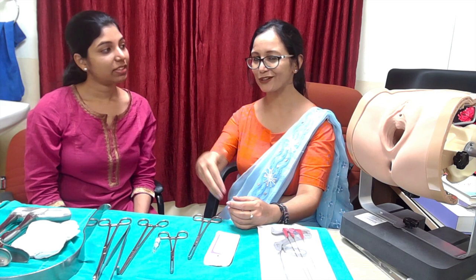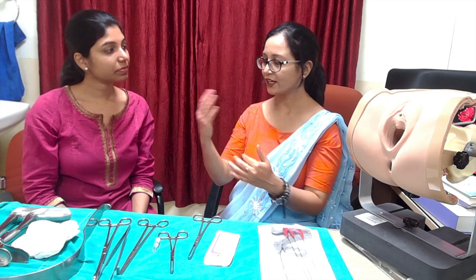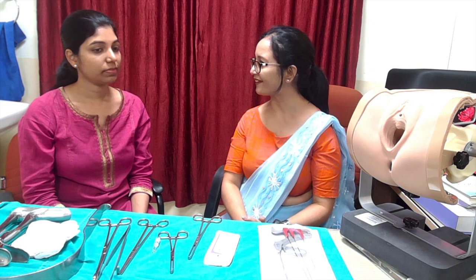If monopolar cautery is not available, you can use a long-handled blade — a BP handle with a size 23 blade. The incision is not a stab wound; it should be around three centimeters long. Then bluntly dissect the area to enter the pararectal fossa, where you expect to encounter fat. Once the pararectal area is open, you need to locate the landmark — the ischial spine.